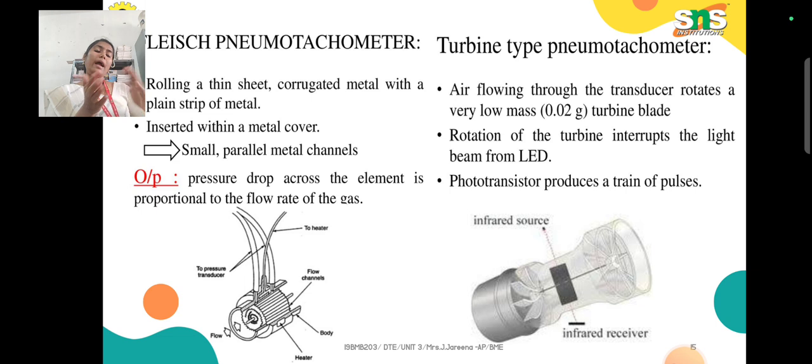This pattern of variation in the pulse is based on the flow rate. It doesn't mean the pulse will not come at the end. The reason is that, based on the rotation speed, some patients will blow the air very hard, or some patients, based on their problem or condition, will blow very slowly.